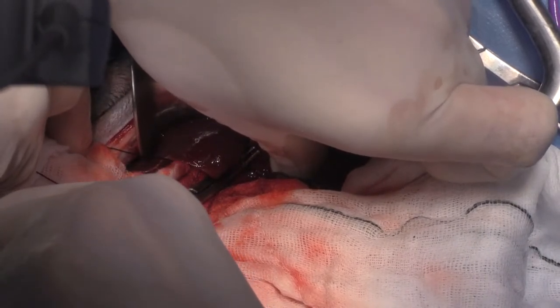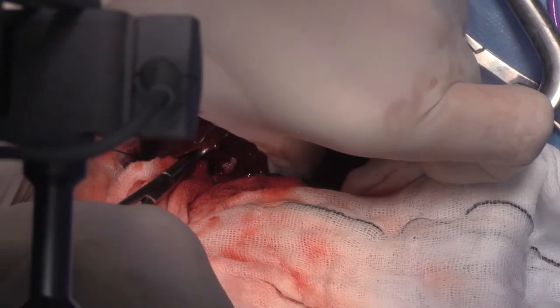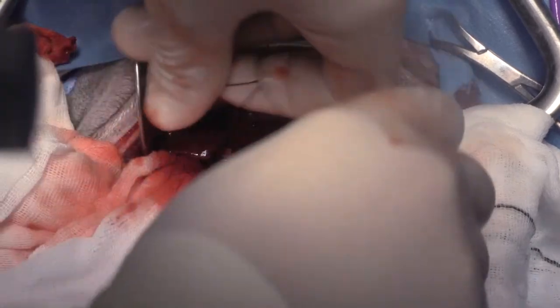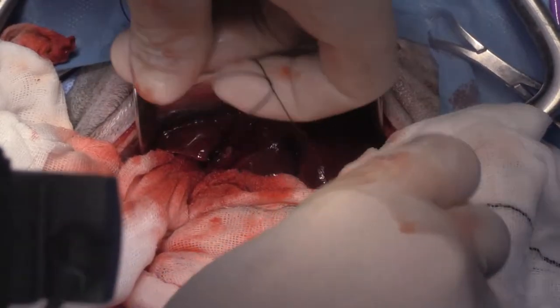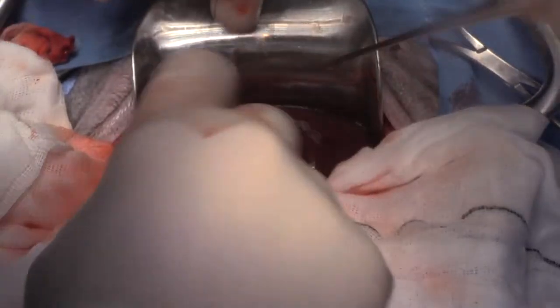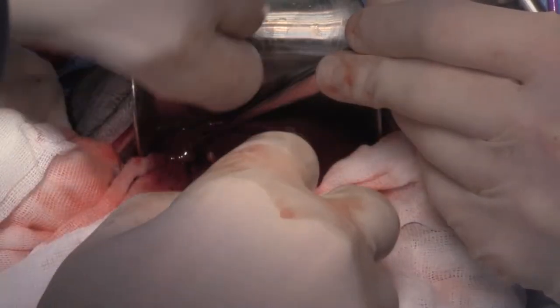Can you pull that little bit of liver lobe as you've come out, just push that out of the way for me? That's great. Okay. Just take it out. So just do a couple of throws on the silk. It's nice, not slipping in the silk. Generally 2 throws is adequate actually, but we're going to do 4 just to make me sleep better at night.